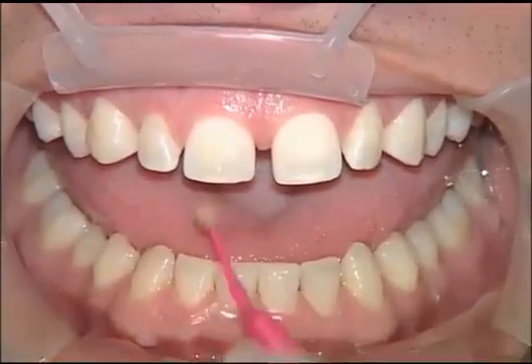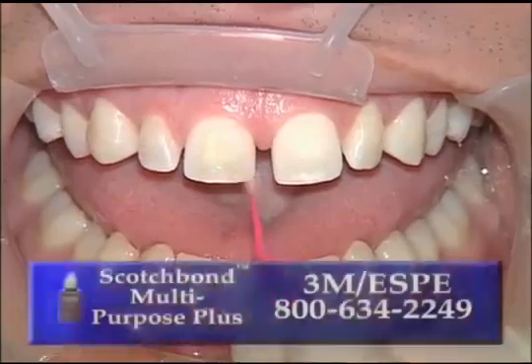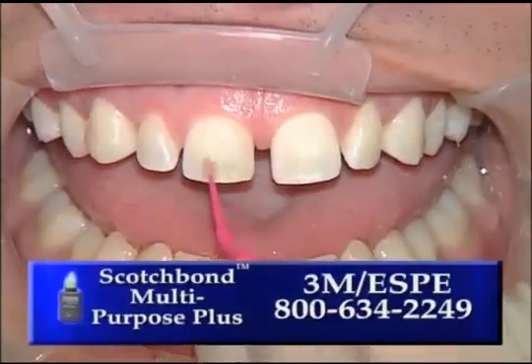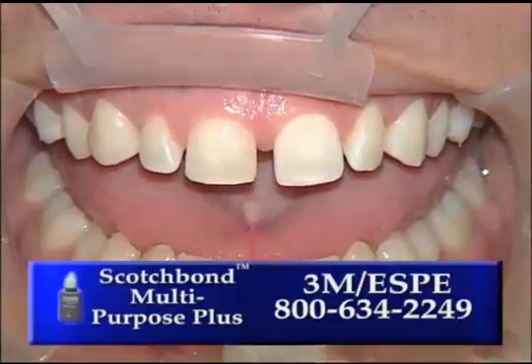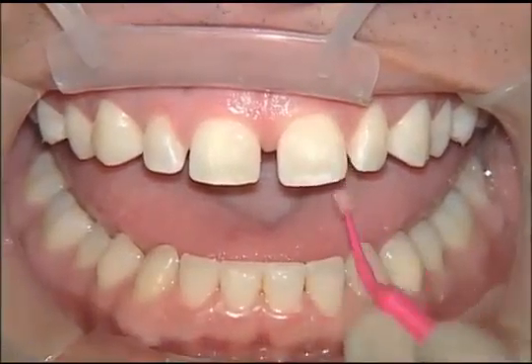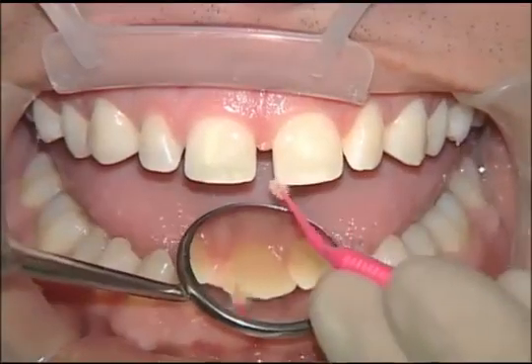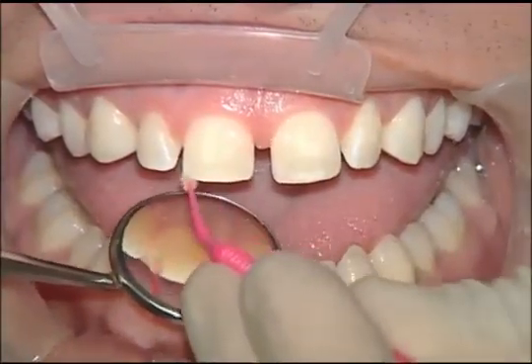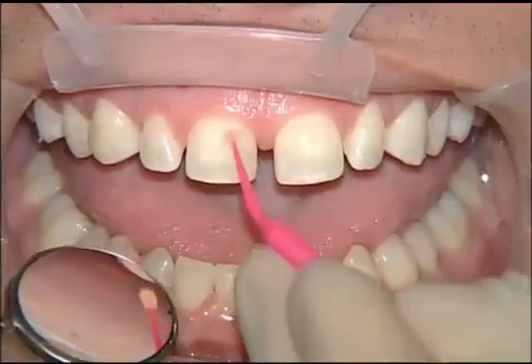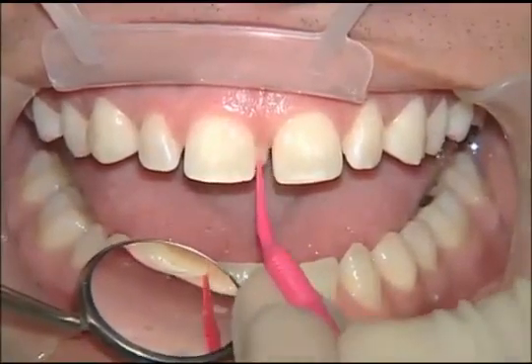What we're placing here is not your typical dentin bonding agent. This is just the adhesive from the Scotch Bond Multi-Purpose Plus kit. And because we don't have any exposed dentin, we can just use the adhesive. There is no need for primer. So we're going to go ahead and coat the entire etched enamel surface with the adhesive from the Scotch Bond Multi-Purpose Plus system, as well as making sure we get the lingual third as well, because the veneer is going to wrap over the incisal edge.